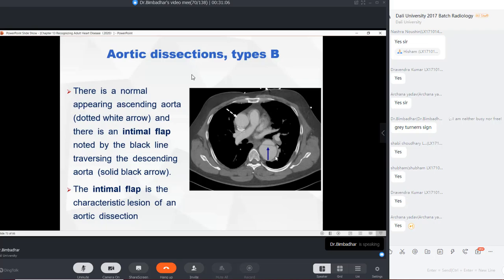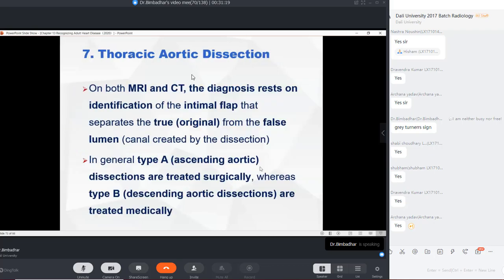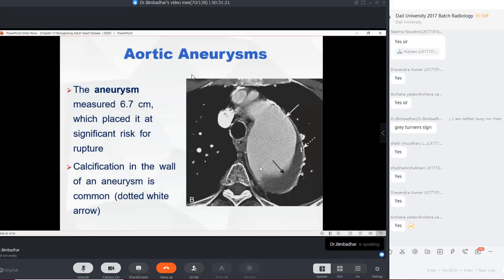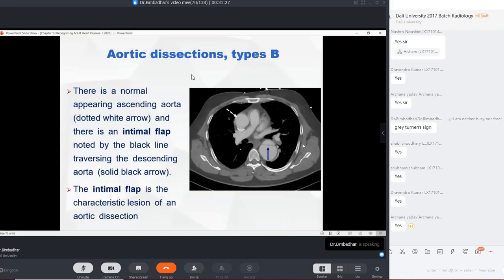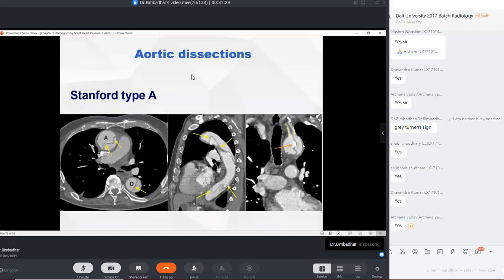Classification is at a higher level; only after you complete surgery will you be aware of all these conditions. But in radiology, it's not necessary at this level. Just remember the X-ray image and these images. That's what you have to remember.